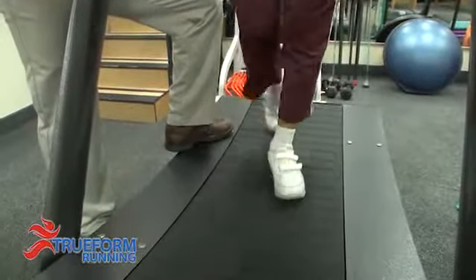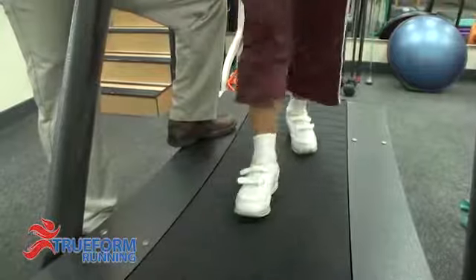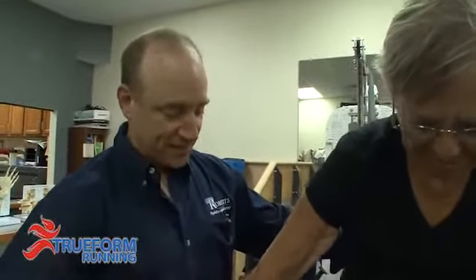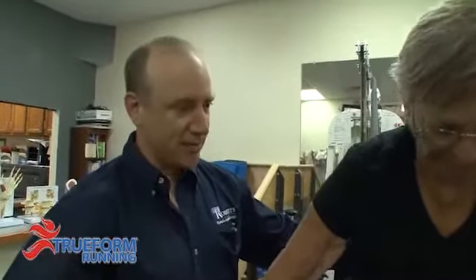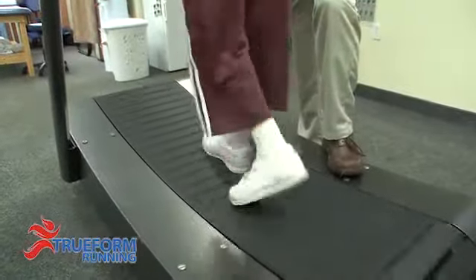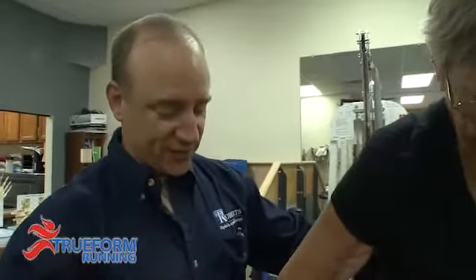I can see this being a benefit for anyone who has balance that's compromised, weakness in the legs, difficult time with foot strike, people that have had foot drop issues, knee problems, hip problems, and back problems. This new technology is going to force an extra level of control, force the patient to work a little bit harder to get themselves better faster, and more than likely speed up the rehabilitation process.